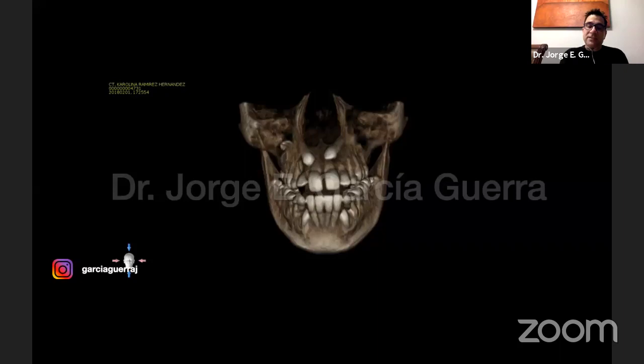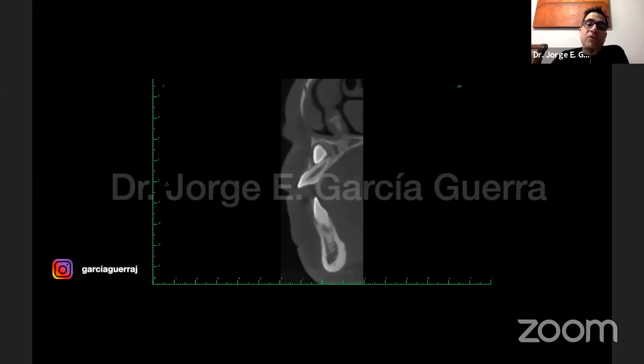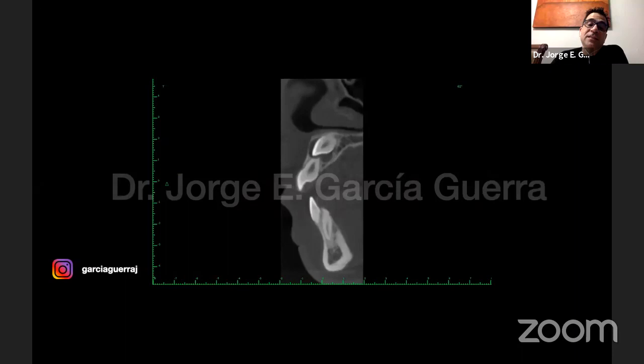So what we're doing here, I'm going to move a little bit fast. You can see the CBCT, what the position of the canine was with the lateral incisor. That's why it was very proclined, but we can see that it wasn't affecting the root. Now on the other side, this is the canine with the central incisor. It was starting to cause some resorption of the root. So it was very important to start the treatment here.